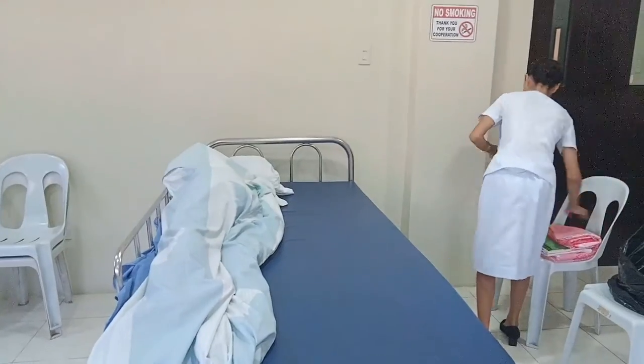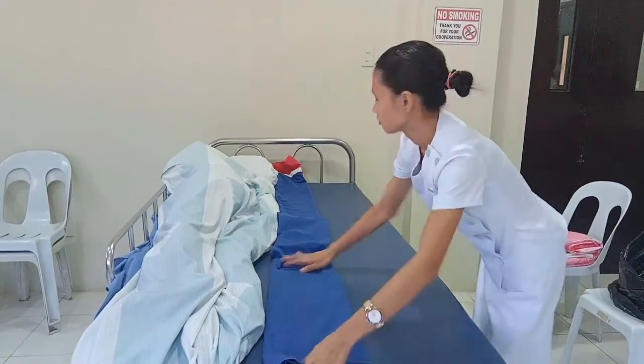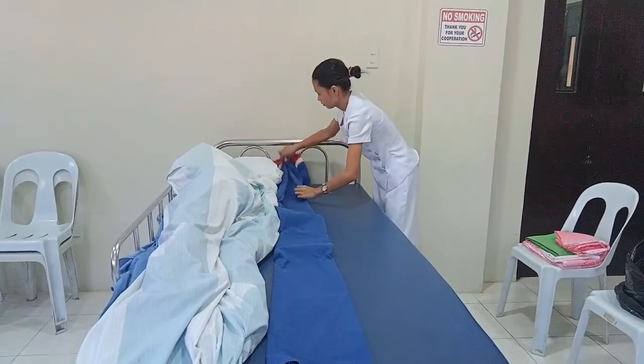Place the new bottom sheet on the bed and vertically fan fold the half to be used on the far side of the bed as close to the client as possible.